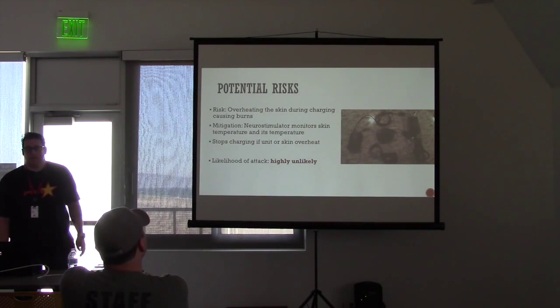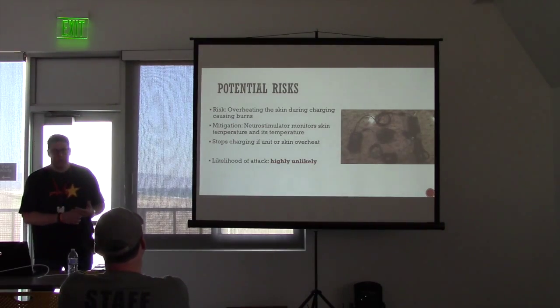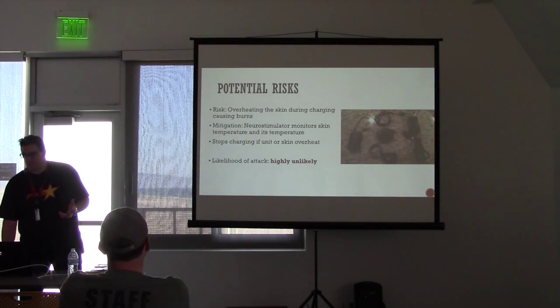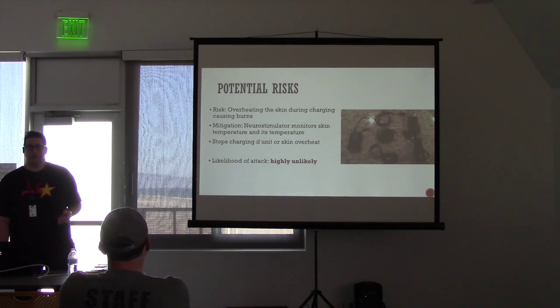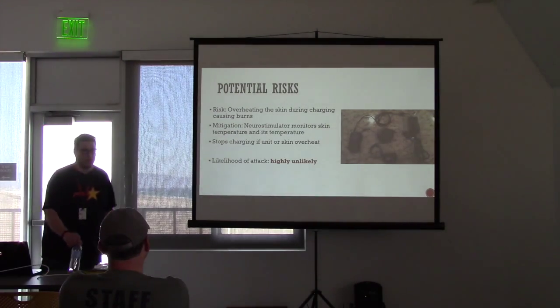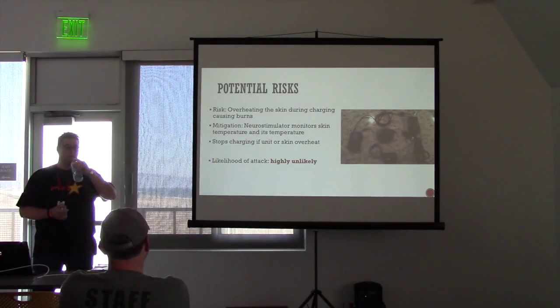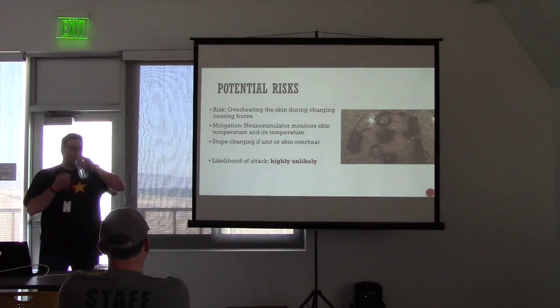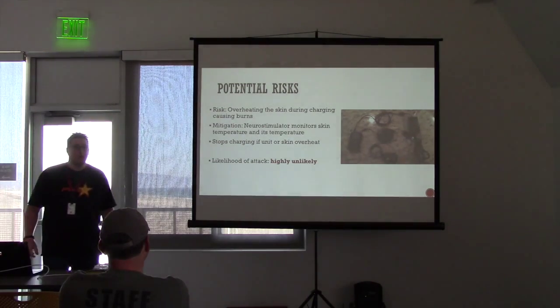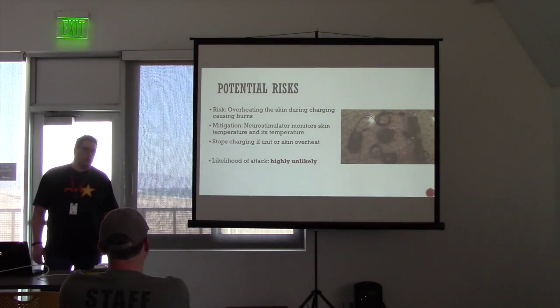Likelihood of attack, you'd have to find a way around that protection in the device, and I'm not saying it's not possible, but it would require some reverse engineering. Even if it cuts off the wire, I'm assuming it's an induction coil inside that's receiving the signal and charging the battery. Even if they cut that off, the antenna could still do that. The receiving antenna. Well, yeah, but that antenna is minimal, it has no range.